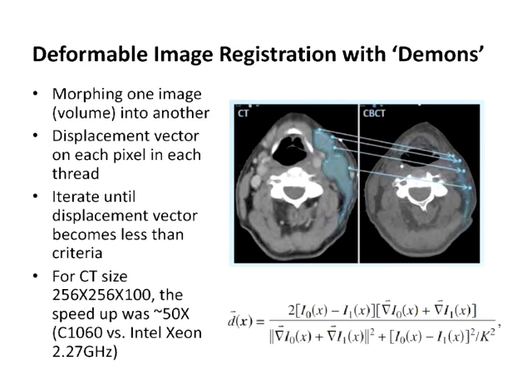The algorithm is here: I0 is the intensity of the original image, and there is a velocity on each pixel for morphing from the original to the later image, involving the intensity of the later one. So what we did is that each pixel is thread parallelized. And for this volume of CT size, we got almost 50 times speedup. The GPU ran on a C1060, and the CPU ran on one core of a Nehalem.